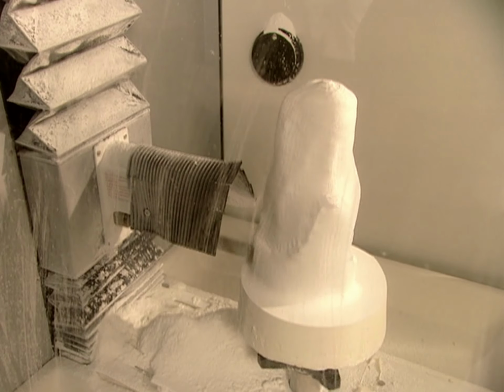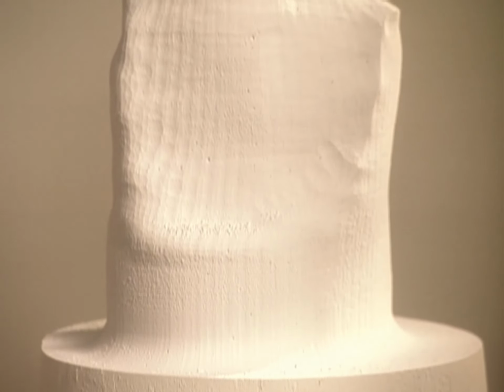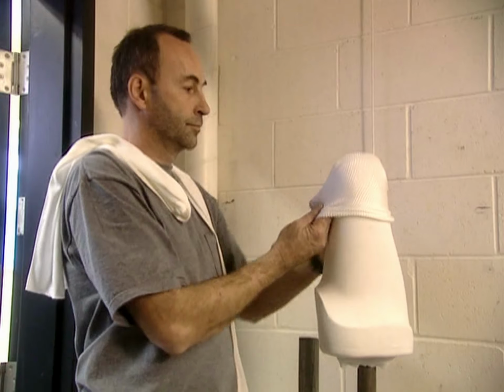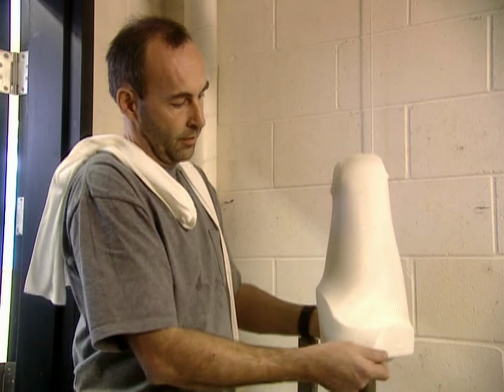With either technique, once the positive mold is ready, they can make the artificial limb. The process they used is called lamination. First, they cover the mold in fabric socks, some made of nylon, others of a material that contains fiberglass. They layer 6 to 10 socks in all, depending on how rigid they want the artificial limb to be.